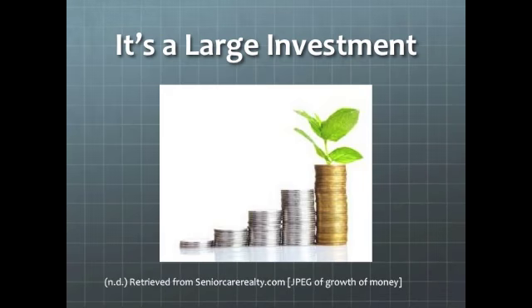Implementing PACS within an institution is a large investment. PACS can be purchased from a variety of medical imaging vendors including GE, AGFA, and Siemens. The most efficient and effective PACS solutions support all diagnostic imaging modalities. The cost of purchasing and installing a PACS system depends on the size and software needs of each organization. PACS is a major investment for any healthcare organization. Proper PACS selection requires ample time, personnel, and research.